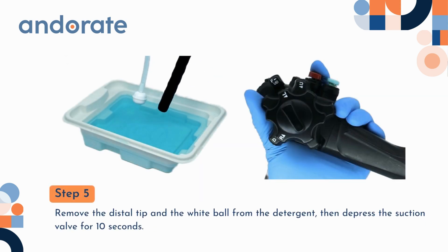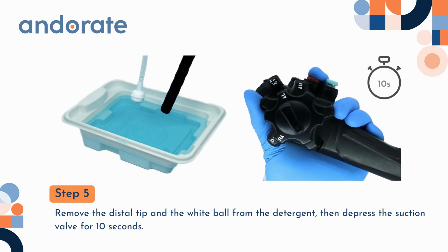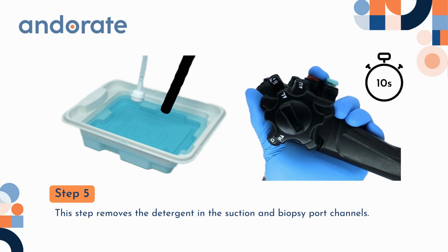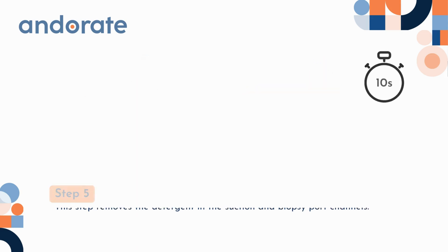Step 5. Remove the distal tip and the white ball from the detergent. Then depress the suction valve for 10 seconds. This step removes the detergent in the suction and biopsy port channels.